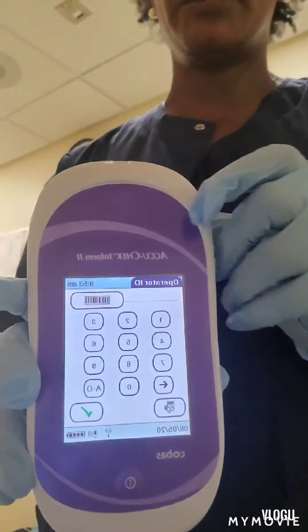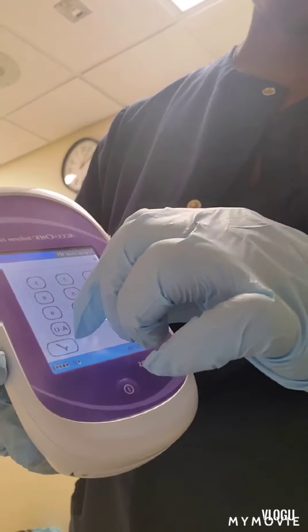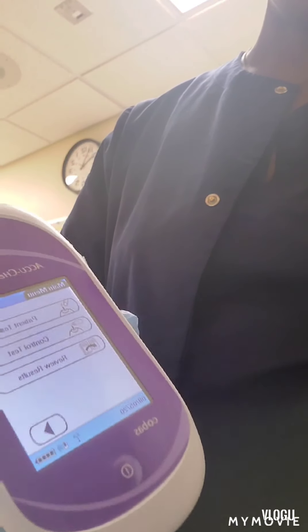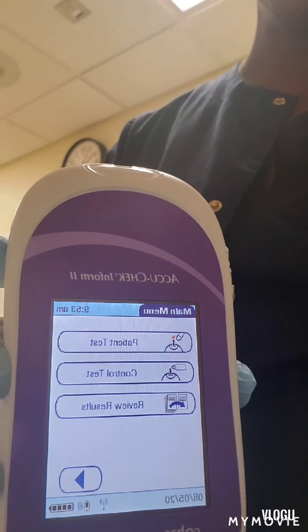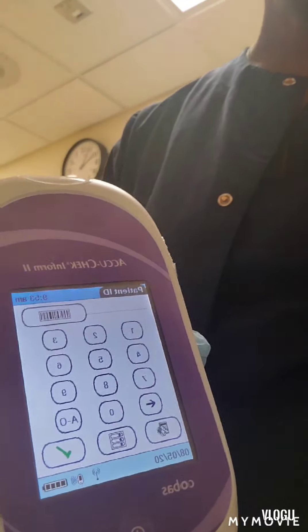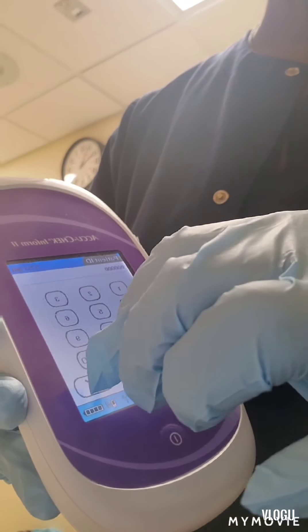The next thing we're going to do: the machine is asking us to enter the operator's ID, but for the sake of the video, we're going to press four zeros and push the check mark. Then the machine asks us to either select patient test, control test, or review results — we're going to select patient test. It's going to ask us to type in the patient ID number, so for the sake of the video we're going to type in six zeros, then push the check mark.